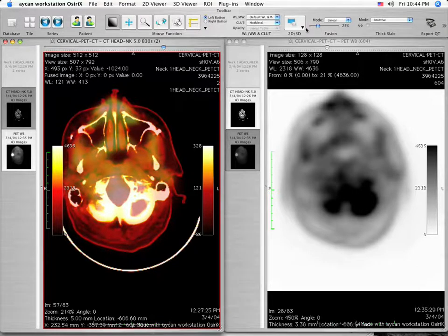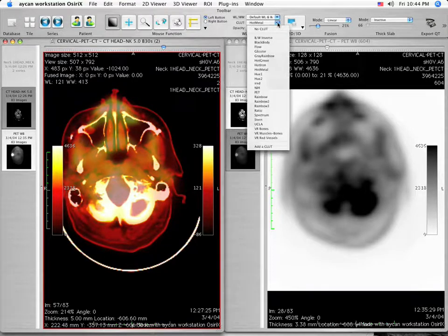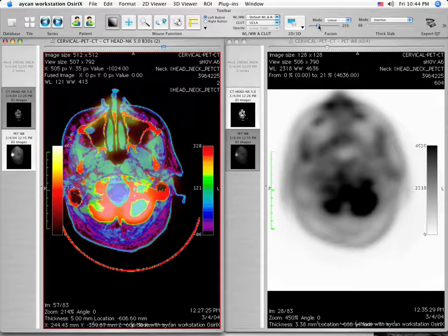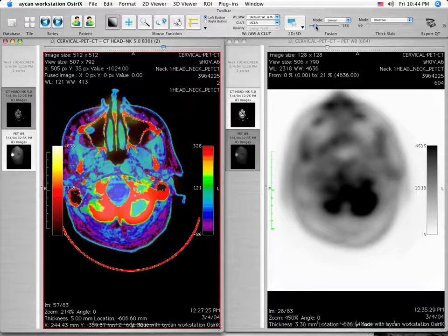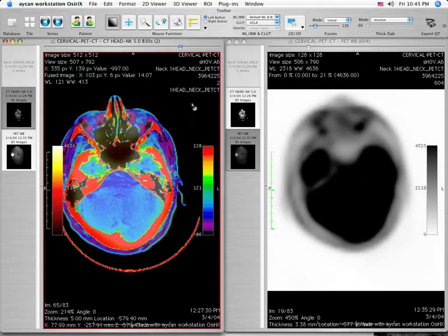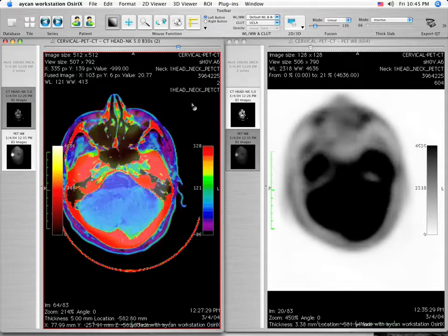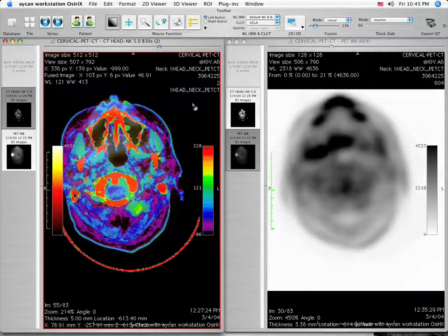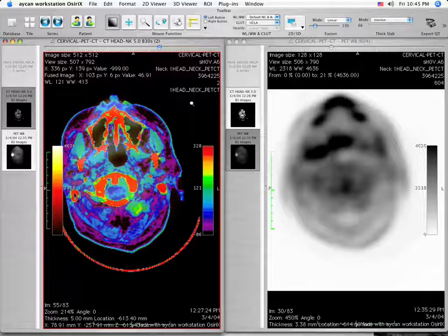As a note, if you are using series from two different scanners, you will need to manually synchronize the image levels before performing the Fusion function. Instructions for loading the series from two different studies for simultaneous viewing can be found in the Basic Image Manipulation and Viewing section of this DVD.